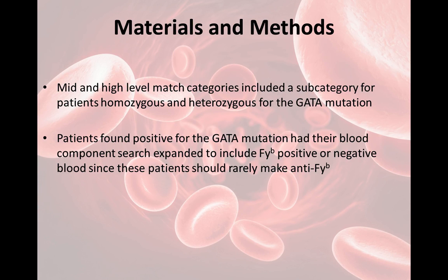Patients who were found positive for the GATA mutation had their blood component search expanded to include Duffy B positive and negative blood, since these patients should rarely make anti-Duffy B.